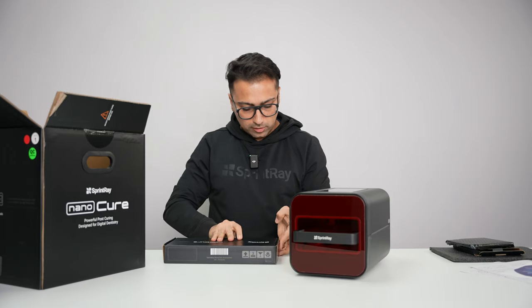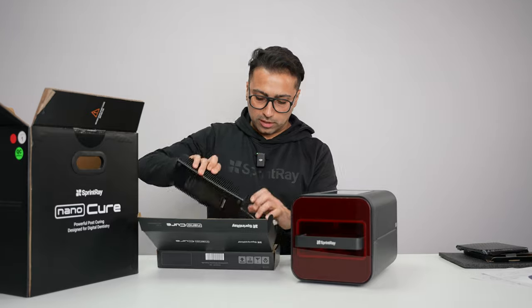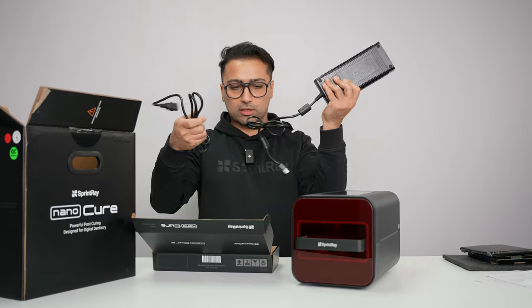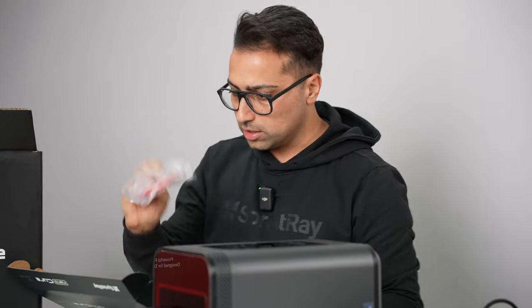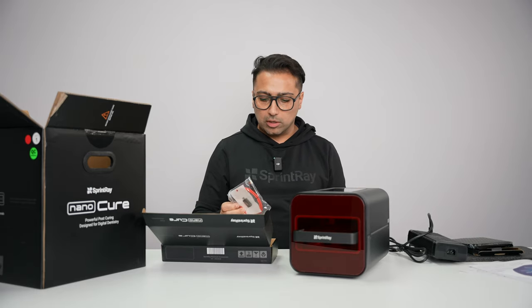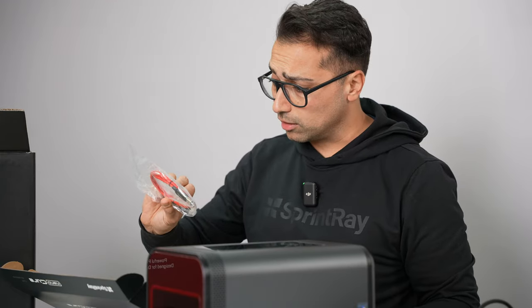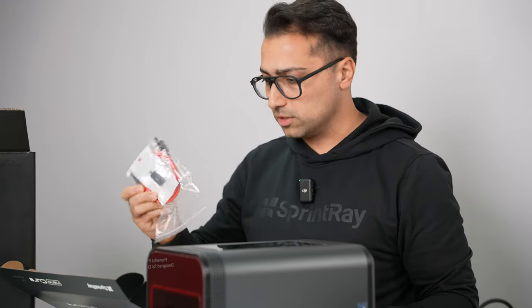This is where you can find the power brick and USB cable and any other accessories that ship with it. Here's the power brick, as well as the power cord — USB-C. You won't need this; most of the updates are over the air, but if you ever need it, don't forget it — it's sitting right here. It comes with an adapter for USB-A to USB-C as well.